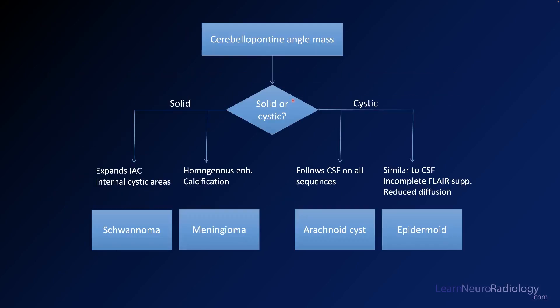First, decide whether the lesion is solid or cystic — specifically, does it have significant enhancing components? In this case, there is pretty solid enhancement. If the lesion is expanding the IAC or has internal cystic areas, that leads you more toward a schwannoma. If it has homogeneous enhancement, perhaps some calcification or dural tails, and may involve but not expand the IAC, then think about meningioma.